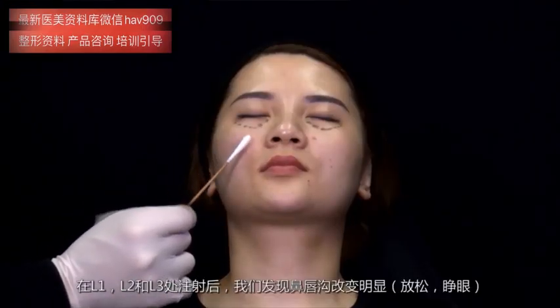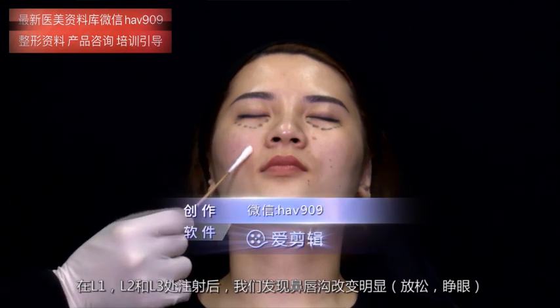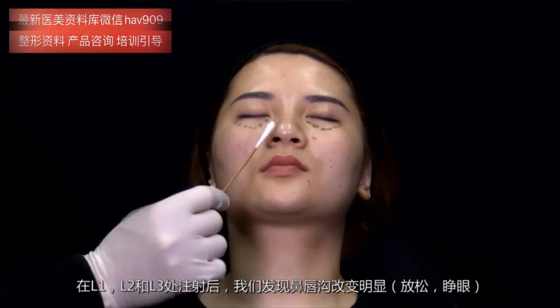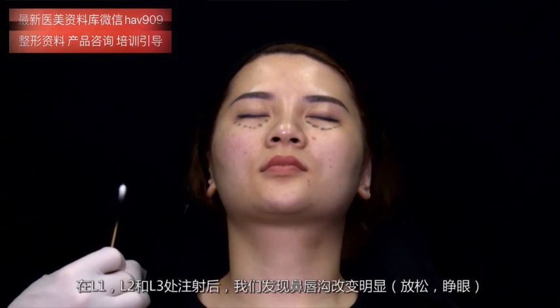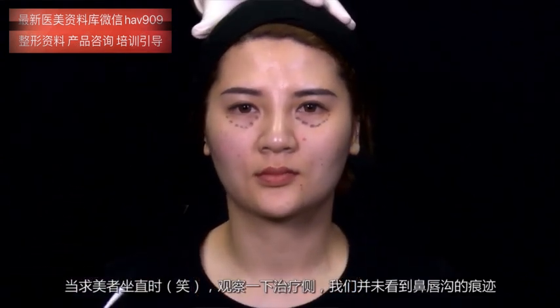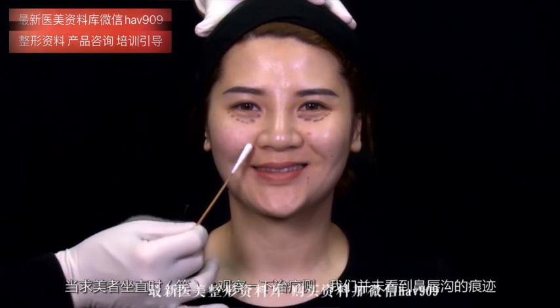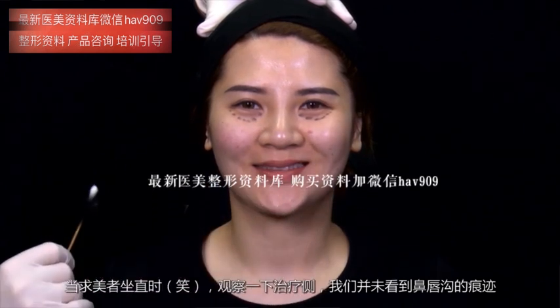So now, after injecting L1, L2, and L3, we notice an important change into the nasolabial folds. Relax, open your eyes, and take a look when the patient sits up. Smile. Take a look that on the treated side, we don't see anymore the nasolabial fold.